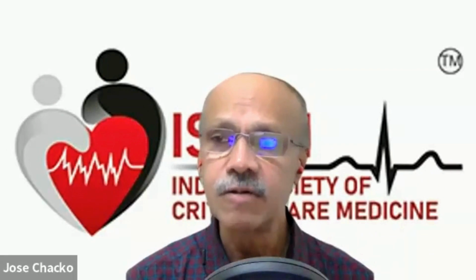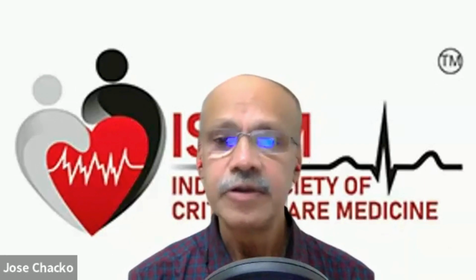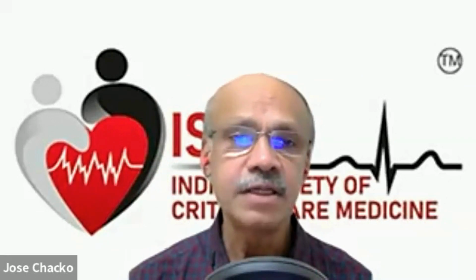volume responsiveness. It is relatively simple to do by the bedside, and it applies in patients who are ventilated versus patients who are spontaneously breathing. So it gives you an overall reasonably accurate picture of volume responsiveness. You need not measure the stroke volume, which involves measurement of the aortic diameter as well. You need not go into that detail. You just measure the VTI alone, baseline and post-leg raise, and see if there is an increment in the velocity time integral, which suggests volume responsiveness.